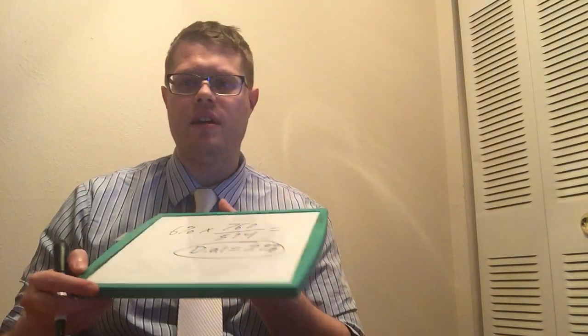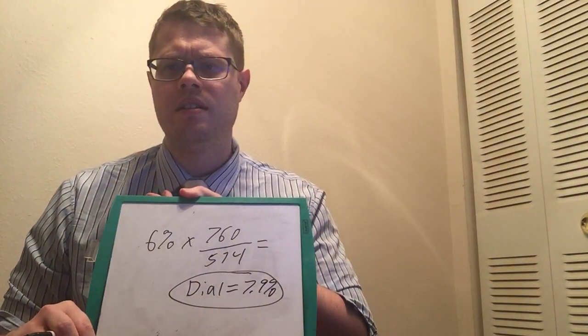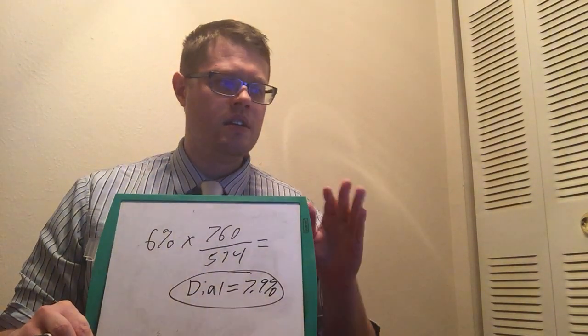I mean, you have it on your screen. Hopefully you're following along. So just learn the atmospheric pressures of different cities. All right, so what else should you know? The vapor pressure math, its relation to one another. Des having the higher vapor pressure has a lower boiling point. Dalton's law, partial pressure, always know that. Change in the altitude, it's always Des. Just know what makes Des different.